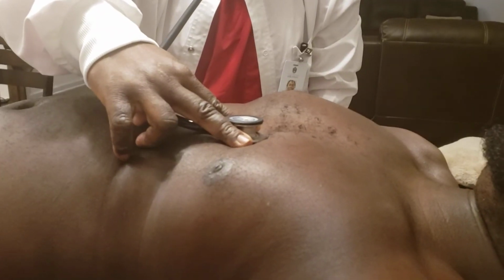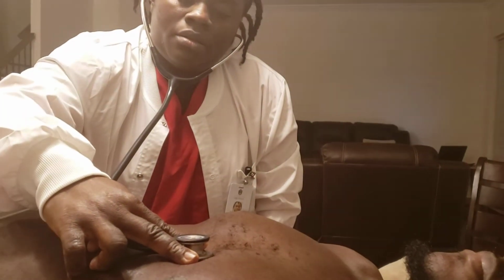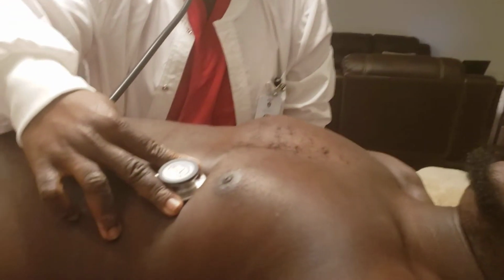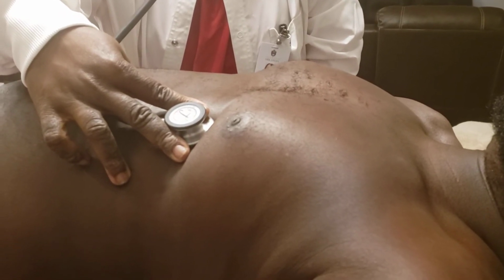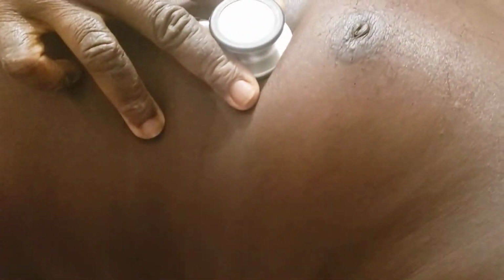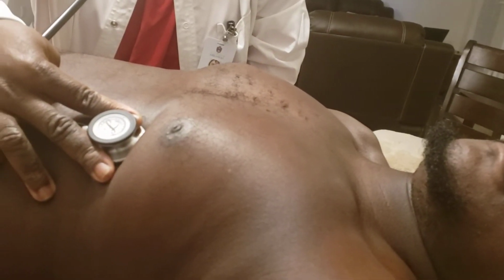I move to the left lower mid-sternal area for the tricuspid valve. Then I move to the mitral area, to the left side of the midclavicular line, between the 4th and the 5th intercostal space. All right. I listen. The S1, the loud sound, the lub, is very loud, louder at the apex of the heart, which is the mitral and the tricuspid. And for the aortic and the pulmonic, the S2, the dub sound, is very loud there.